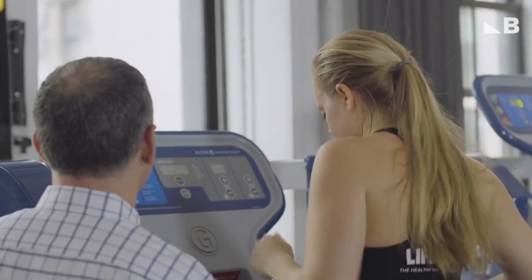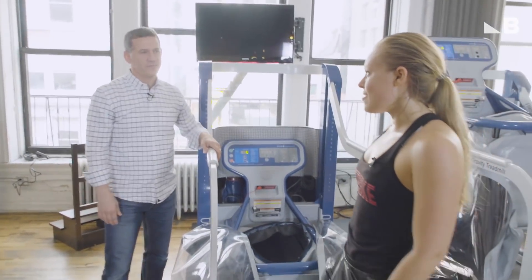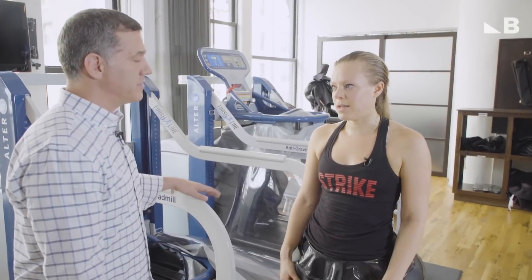Now that you're off the treadmill, how are you feeling? I feel better than after a typical run. My knee is not feeling tight and I don't, as of yet, feel any sharp pains — which I typically do feel after running outdoors. This morning I had pain.